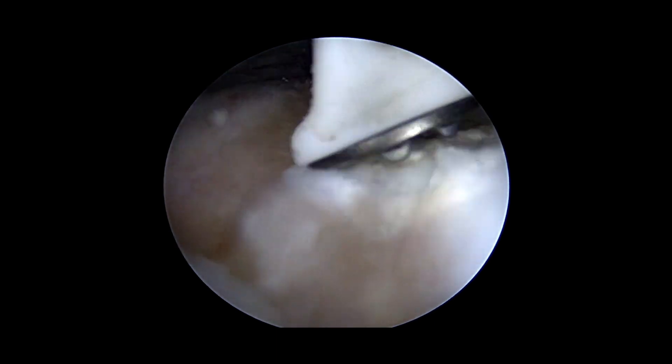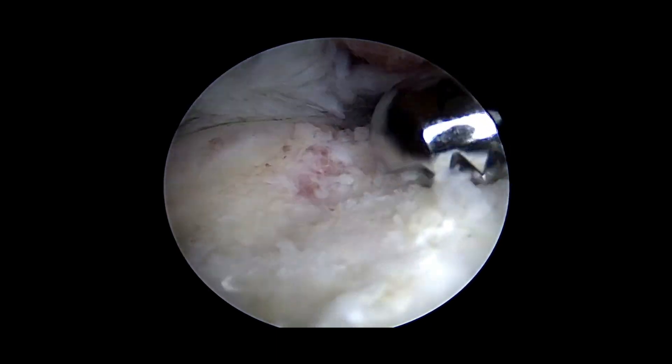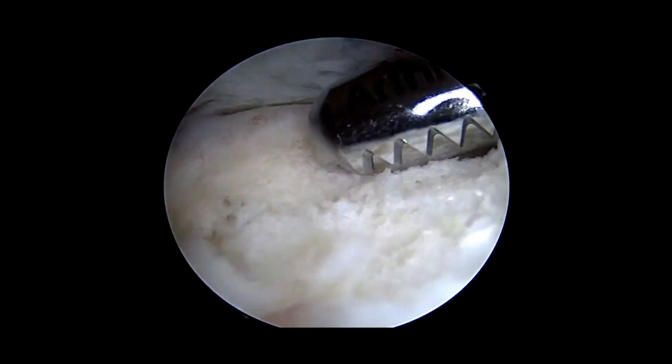We're removing the soft tissue off of the footprint with the radiofrequency probe and shaver. We're now using a burr to create a small trench just behind the medial row to get some nice bleeding bone.